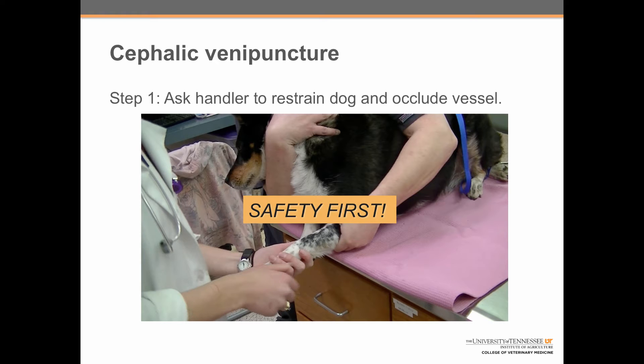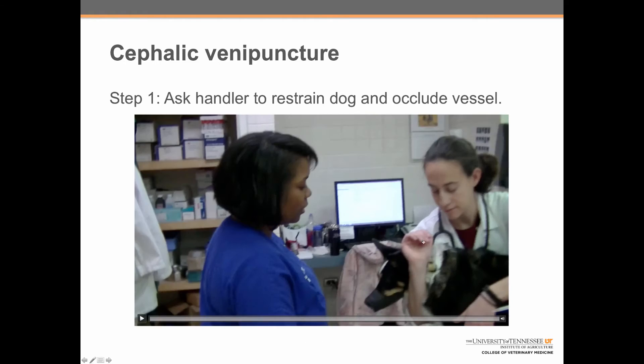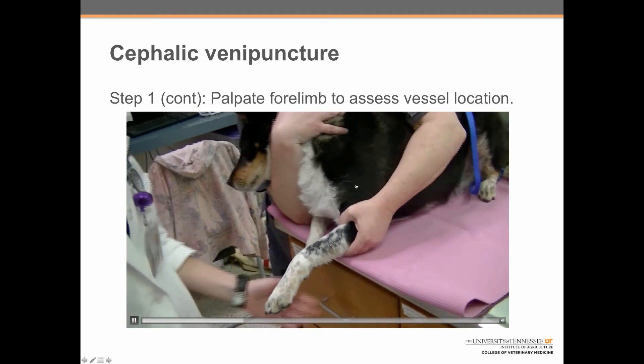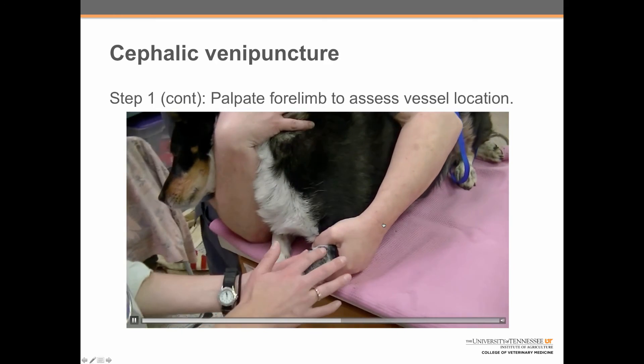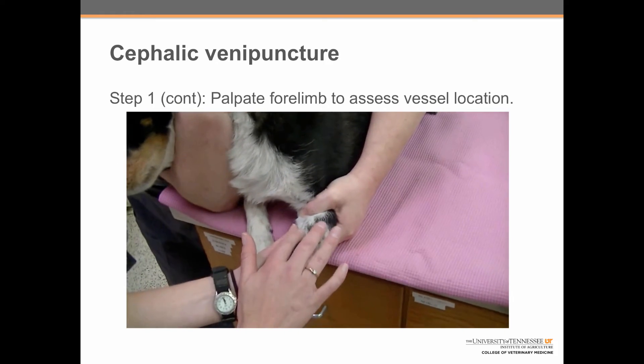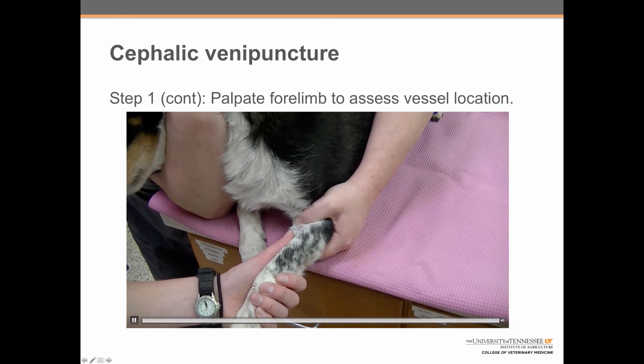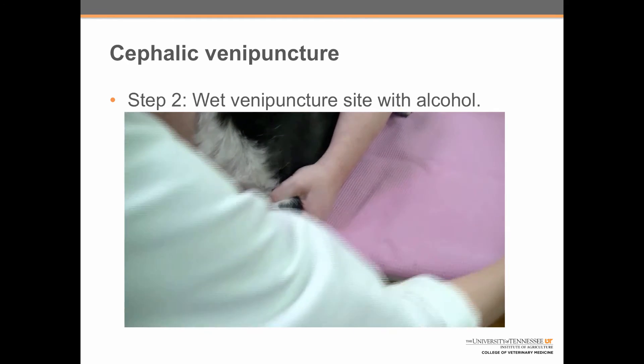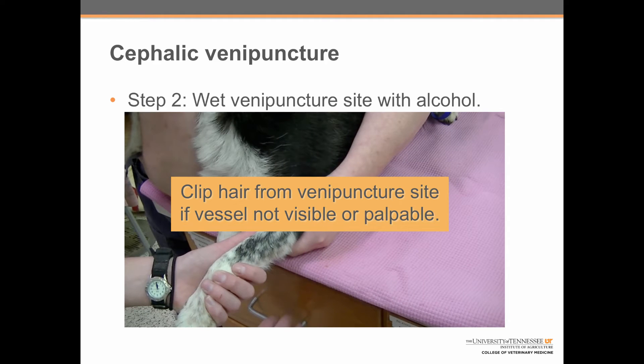It's always important to remember safety first. If you have a dog that is untrustworthy, it's always okay to put a muzzle on the dog before proceeding. The second part of step one is to palpate the limb to assess vessel location. Here we can see Abby extending the limb and putting her thumb across the inside of the elbow to occlude the vessel. The student uses her dominant hand to feel for the vessel as it runs along the top of the forearm. If you can't see or palpate the vessel, it's okay to clip the venipuncture site — just be sure to get the owner's permission if working with a show dog.